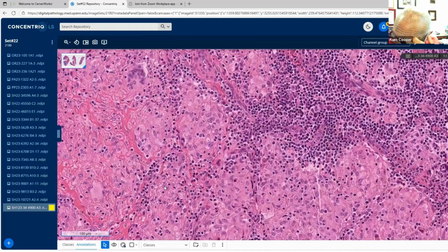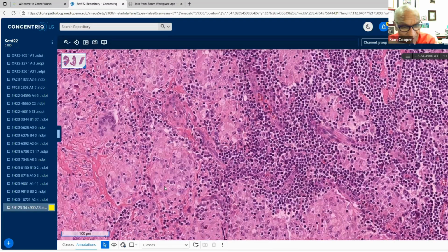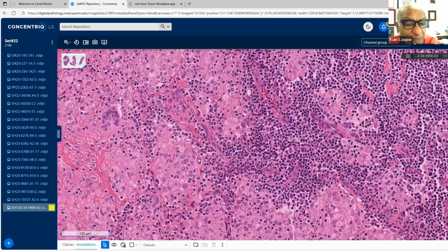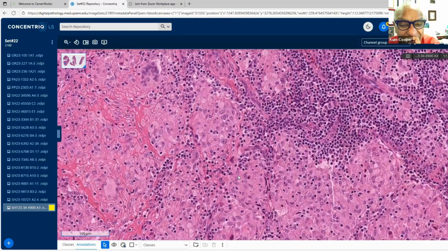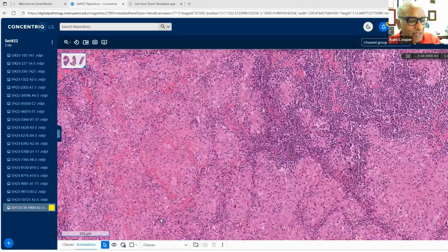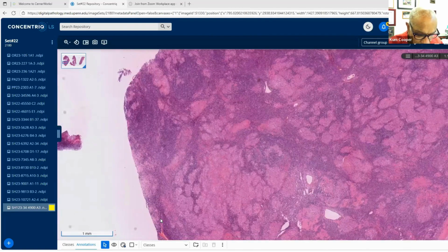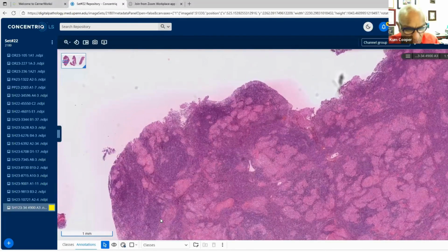Always think of melanoma. So I'm going to give you some homework now because my time is up and your time is up. I don't want to keep you. But think about this. The granulomatous lymphadenitis with these intervening large cells. I'm going to give you a clue. Okay. The paper you want to look at is from John Chan, in AJSP. He talks about this in the context of granulomatous lymphadenitis as a subtype of what we're talking about. All right. That's what I'm going to give you.